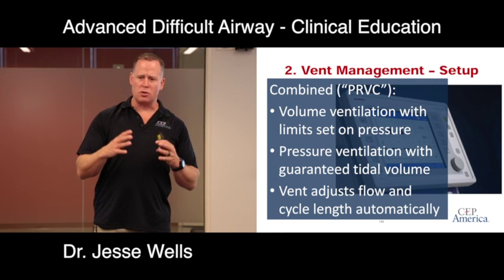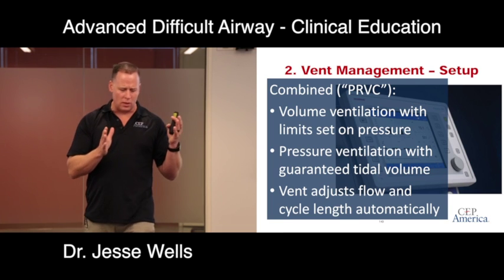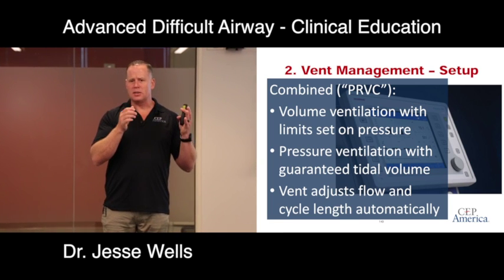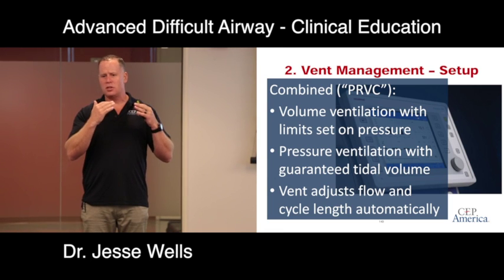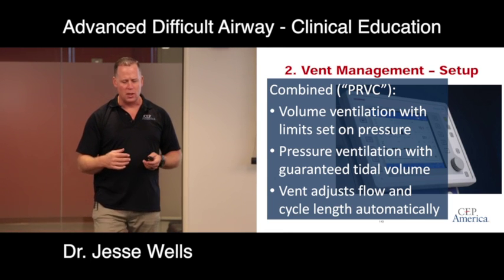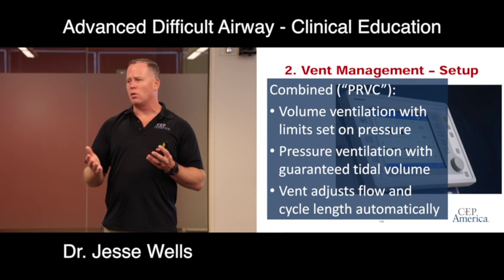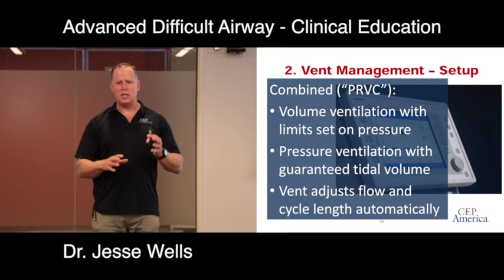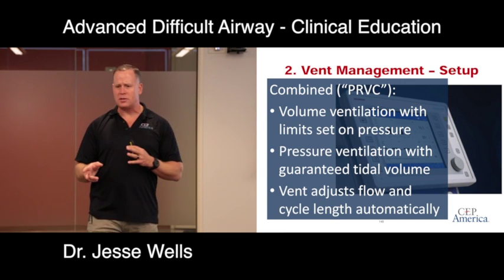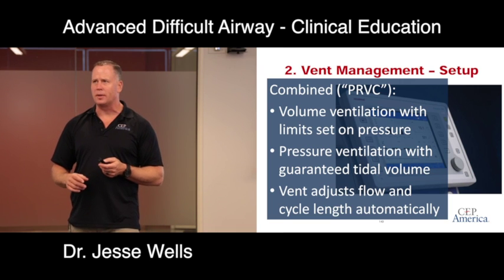And to get the plateau pressure, some ventilators will calculate a plateau pressure, but usually you have to do an inspiratory pause to have the ventilator calculate the plateau pressure. So you have to ask your RT for a plateau pressure. And the other confounding thing is, usually you have to be on volume control to get a plateau pressure versus pressure control. But anyway, you need to know the difference between a peak pressure and a plateau pressure, because that's going to help us troubleshoot the vent when it starts alarming.